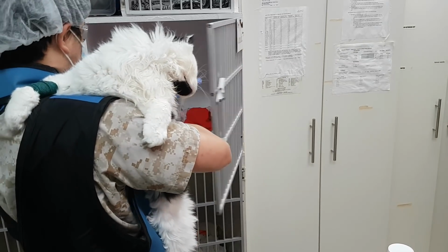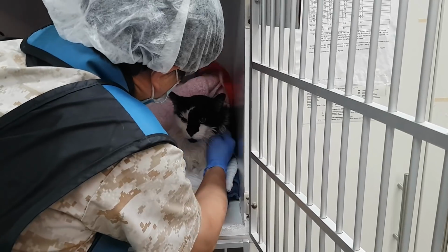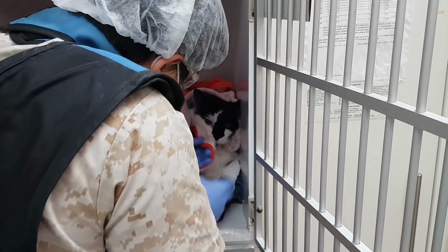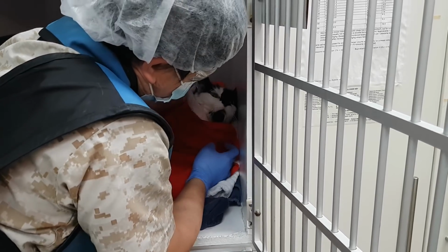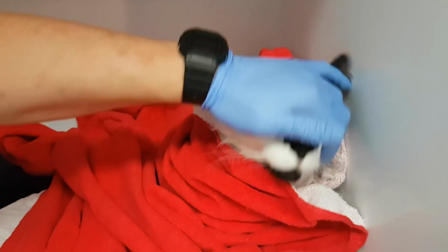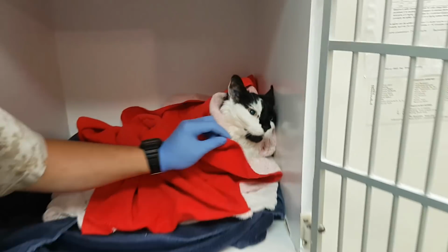There's our boy going off to recovery. And notice how his fur is nice and dry because we draped him in. It can get quite messy otherwise. NJ has made a nice comfy recovery bed for him, lots of towels and blankets so he can be nice and warm and roll around in them, be all comfortable and safe. And Lancelot's tucked in. He won't stay that way for long because cats tend to thrash about quite a bit as they're waking up, but he's having a good time.